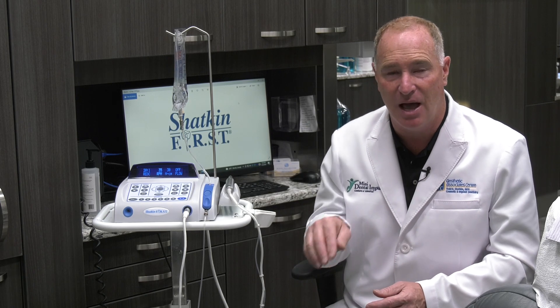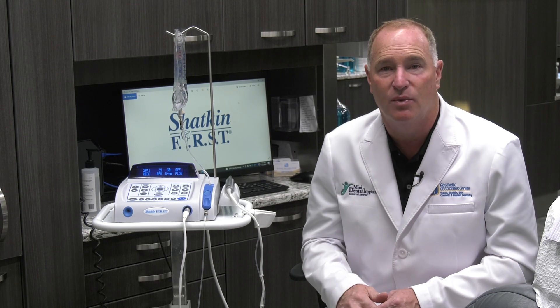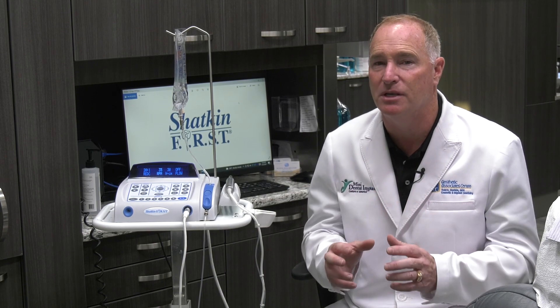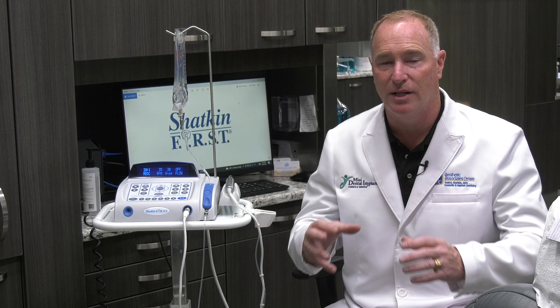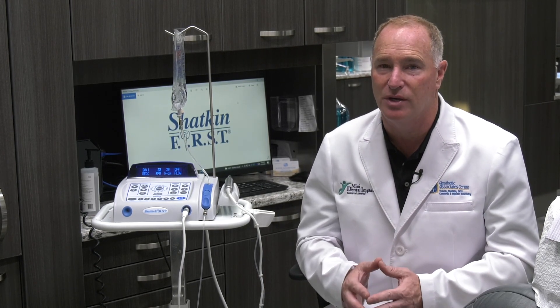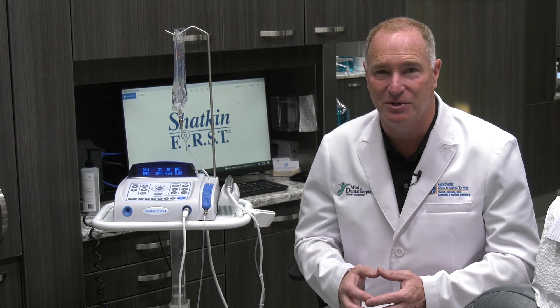If it's in a denture, I would not put the housing on. Instead, put a healing cap on it, cut the healing cap down so it's not touching the denture at all, and hollow out the denture so it just seats passively over that particular implant. You always want to put something on the implant to keep soft tissue from swelling up around the neck. But if you don't reach 30 newton centimeters of torque, my first choice is take that implant out, put a bigger one in, and you'll probably get to that 30 newton centimeters.